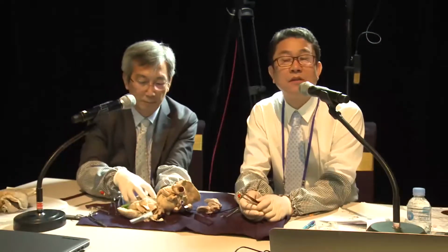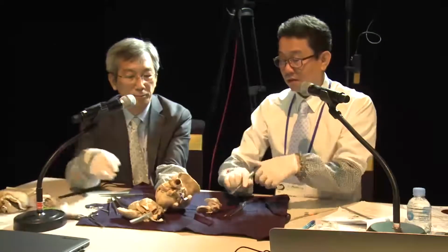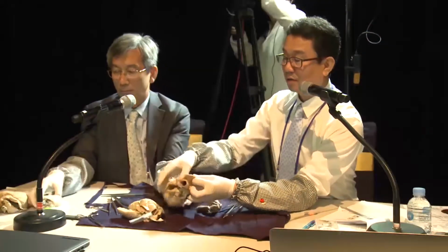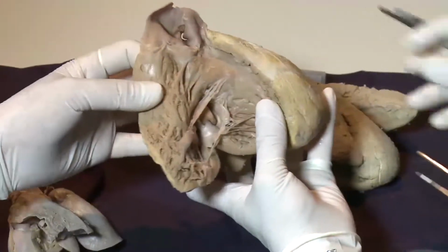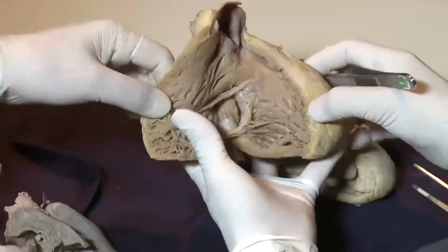So it's so high. So we did not use the plus perimembranous VSD device anymore. But the most frequent congenital heart disease is a VSD. So first, Dr. So will explain about the conduction system using this specimen.